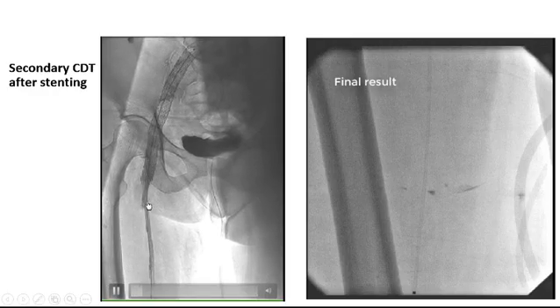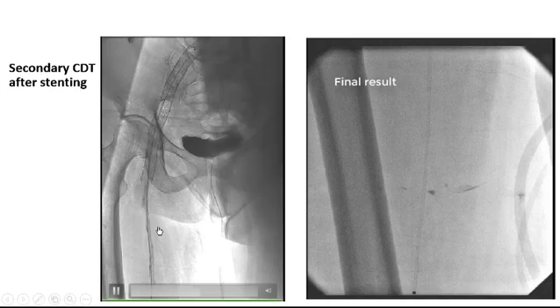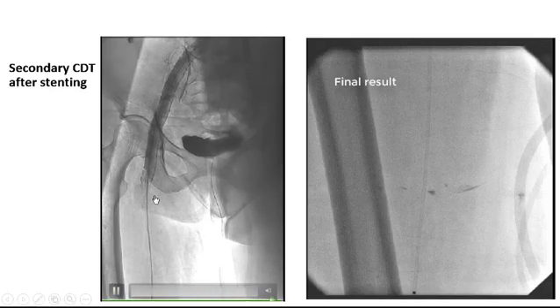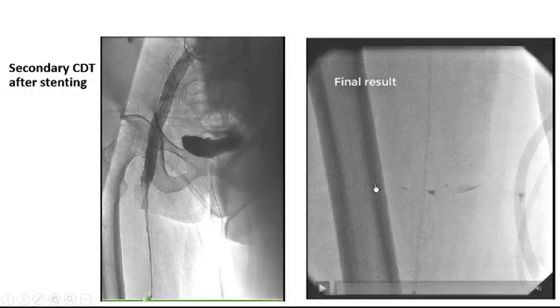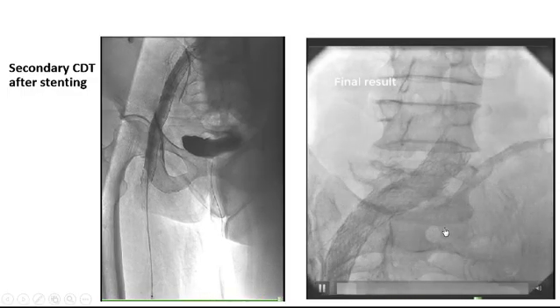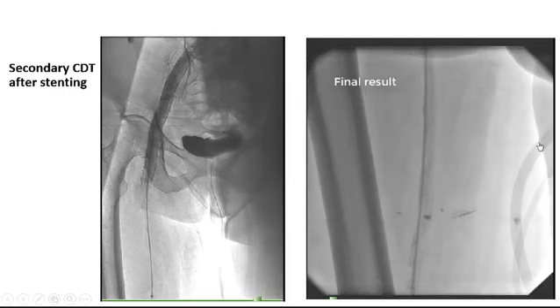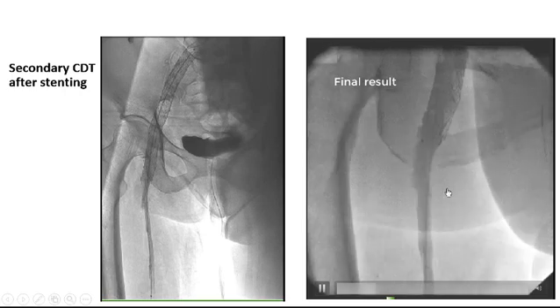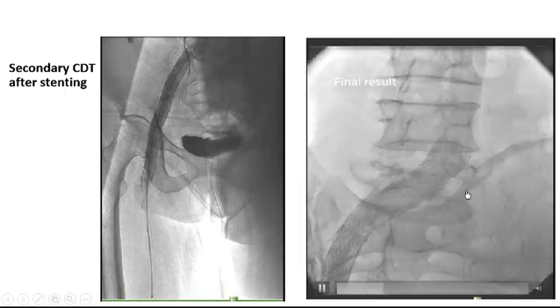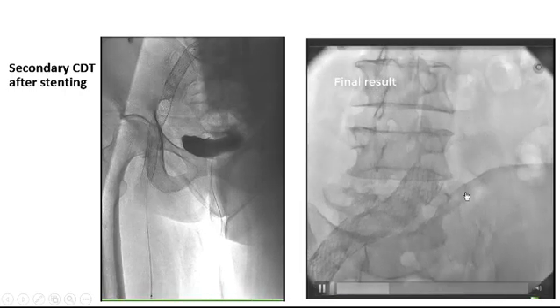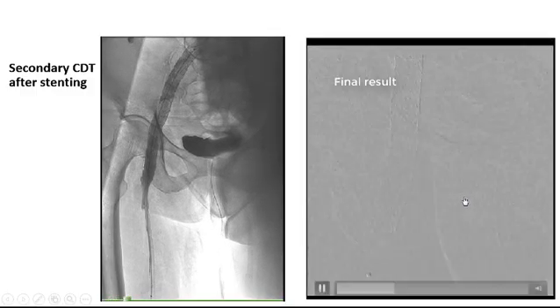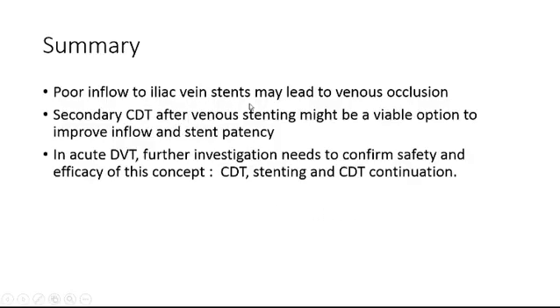We performed CDT again, placing the perfusion catheter within the stent. Injection showed sluggish flow. After 24 hours, the inflow was much better — the speed of flow was faster — and now we could be confident that the stent would remain patent.